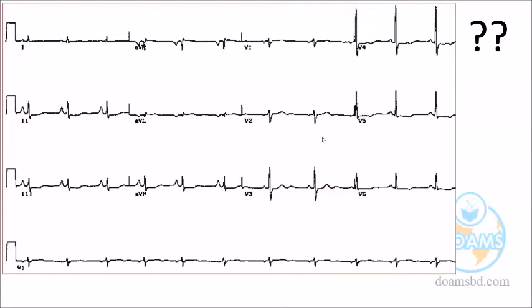Yes, please, doctor. I think in lead 2 and 3 there is some large P wave. You mean the P wave in lead V1? Yes. Any obvious? So what does it mean? This one, high up, is called P mitral. Sorry, P pulmonal. This appearance is called P pulmonal, abnormal P. Pulmonal means the right heart, so it could be right atrial enlargement.